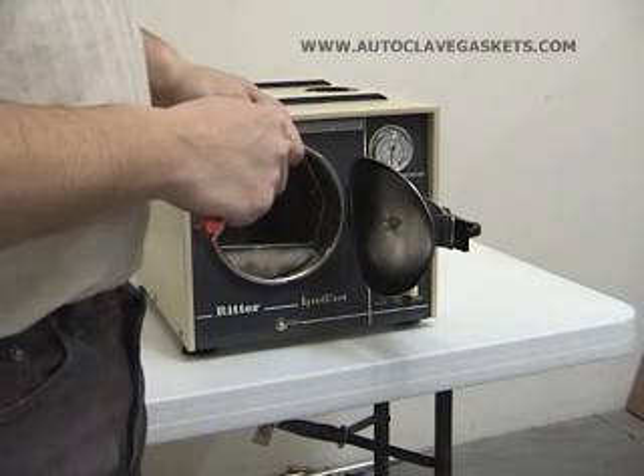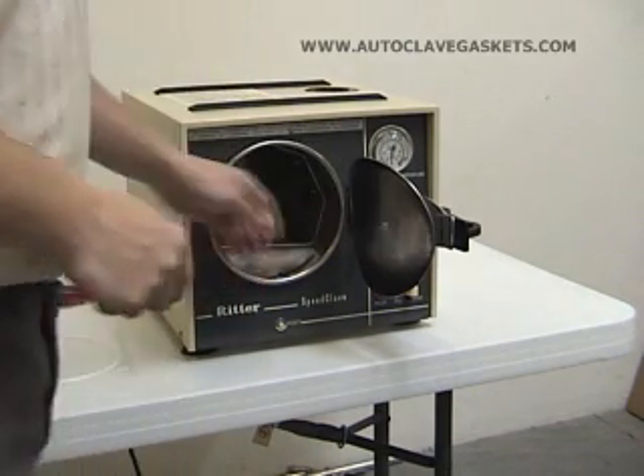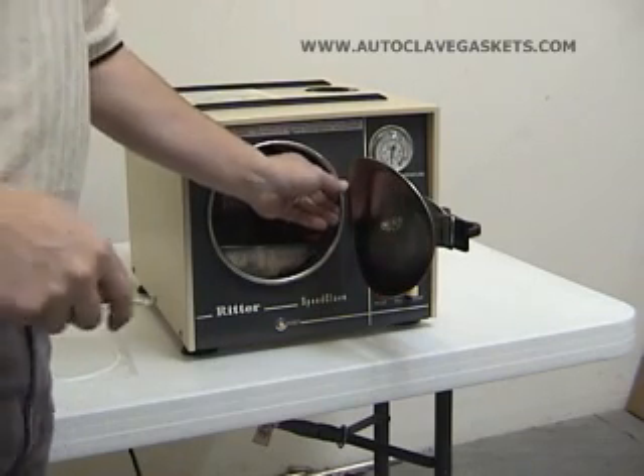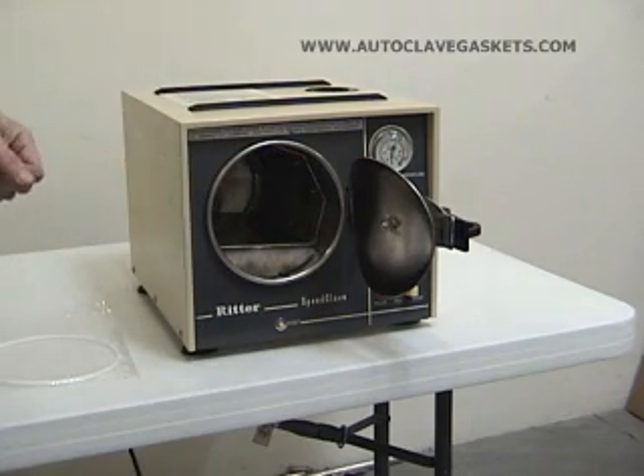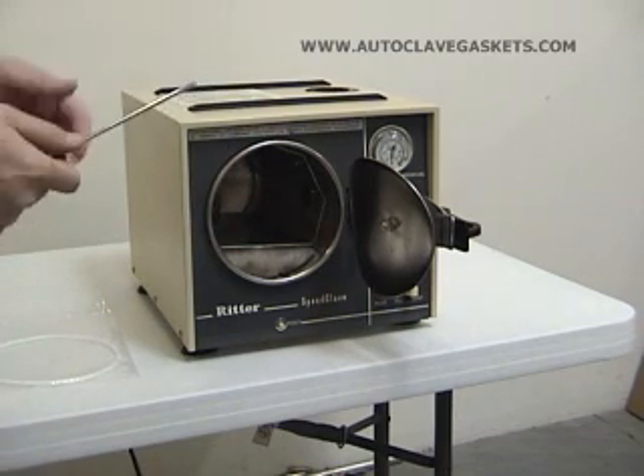This is a video demonstration of replacing the gasket in a Gritter M7 Speedclave. It's really just a simple white O-ring. The first thing we're going to do is take the old gasket out. I just use a small flat screwdriver for that.